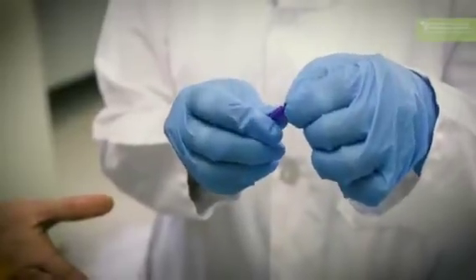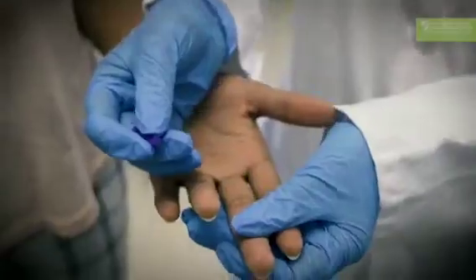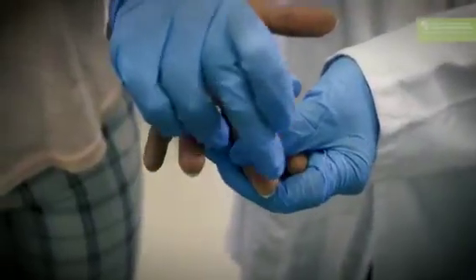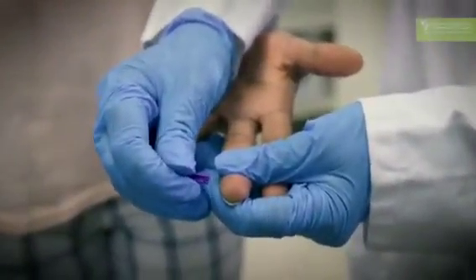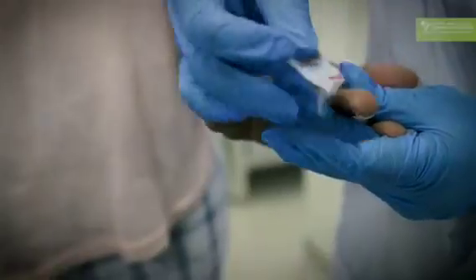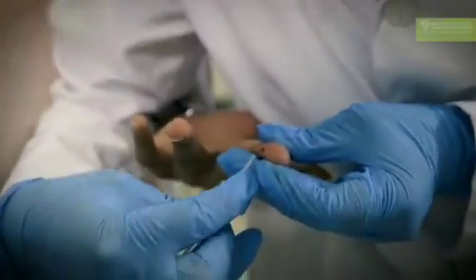You twist off the lid, and then you have the sharp needle. This needle is what you use to prick the finger. You're going to hold the finger pretty tight so you get the blood pooling. You never prick at the center, you're going to prick off center, and you do it in one smooth movement. You wipe the first drop off. You collect.